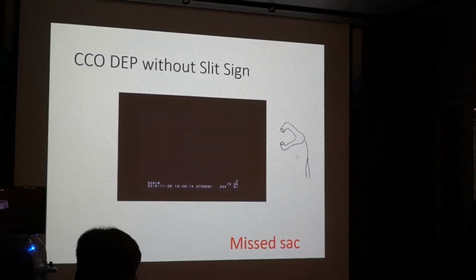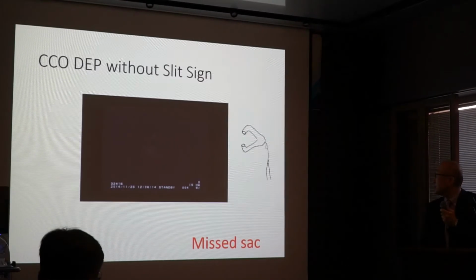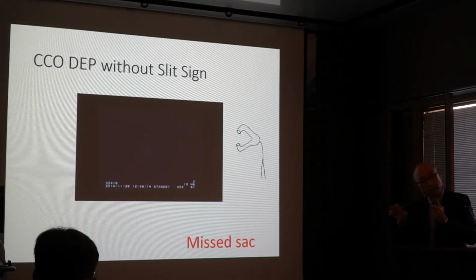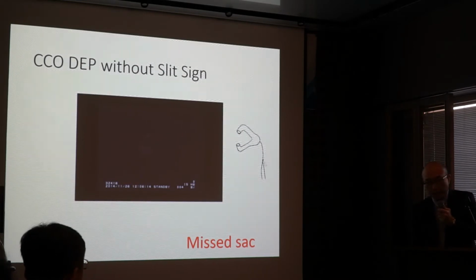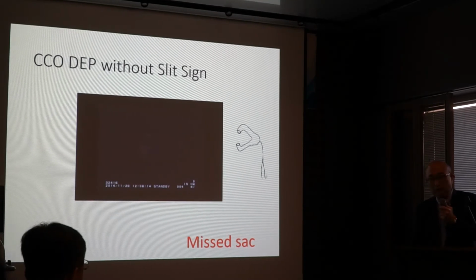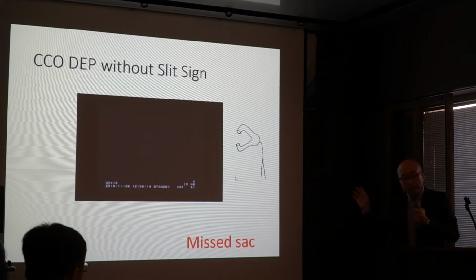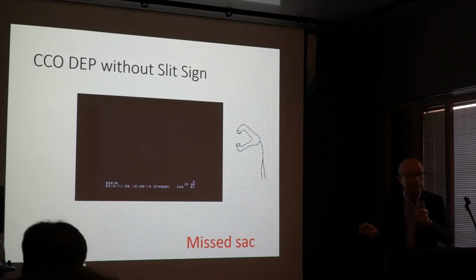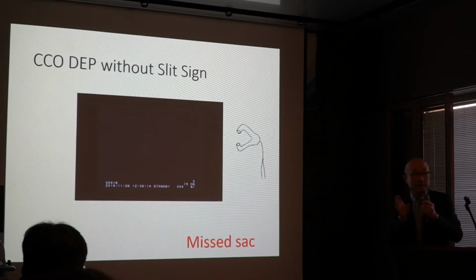So let's summarize this case. In the first depth, the endoscope probe was proceeding in this track. If I had continued, maybe I would have been able to get into the lumen somewhere. But I discontinued. At this timing, someone may think about lacrimal sac fibrosis, but the chance of lacrimal sac fibrosis is very rare.